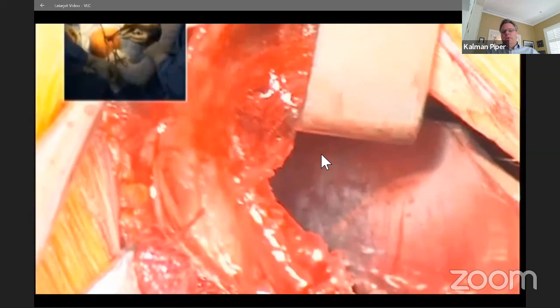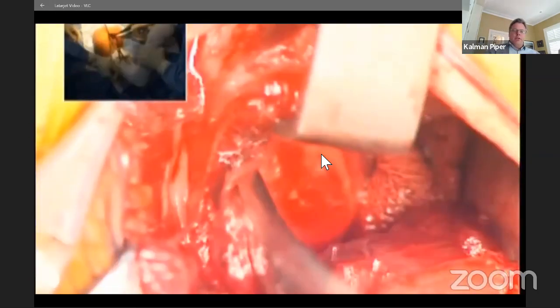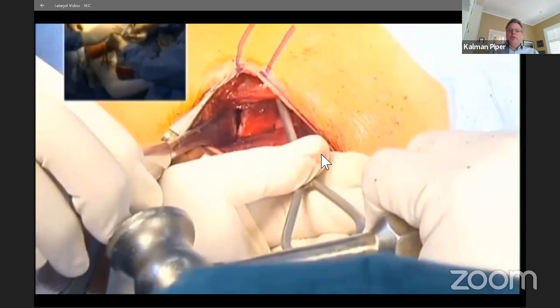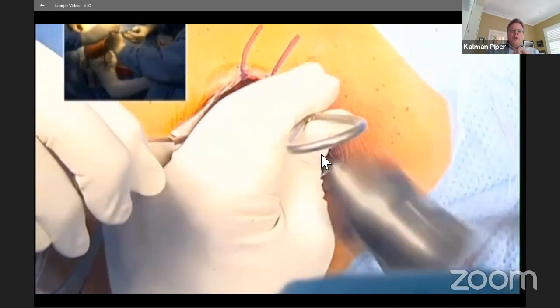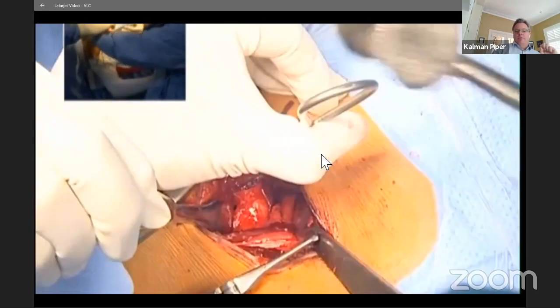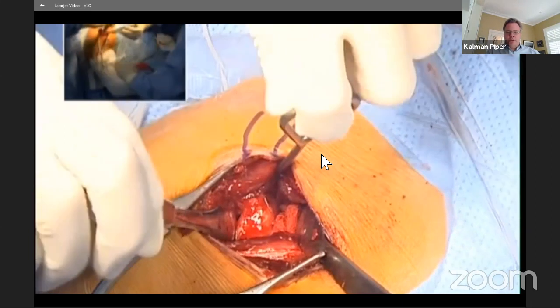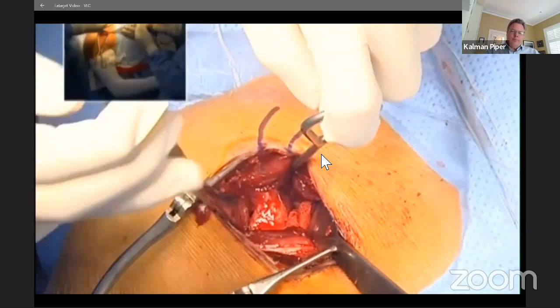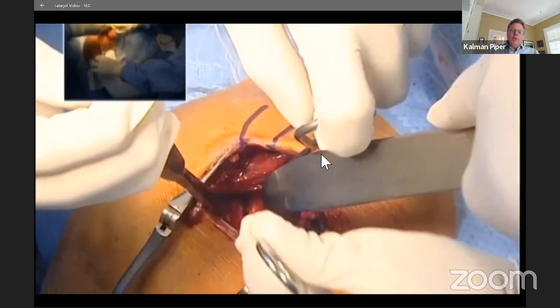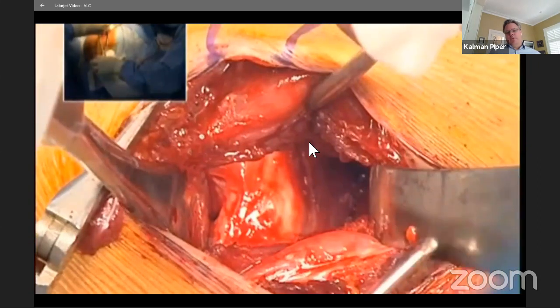But in Australia, we more commonly use a Fukuda retractor. And it's that levering action of the Fukuda that is why I use a bolster behind the medial glenoid neck, because without the bolster, there's nothing holding the scapula, so you end up pushing the Fukuda too far. So this helps hold it forward. That's an anterior Bankart retractor going immediately, replacing that Homan. That gives a beautiful view through a 4-centimeter incision, a beautiful view of the anterior glenoid.